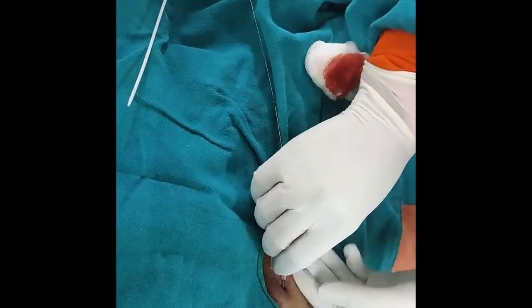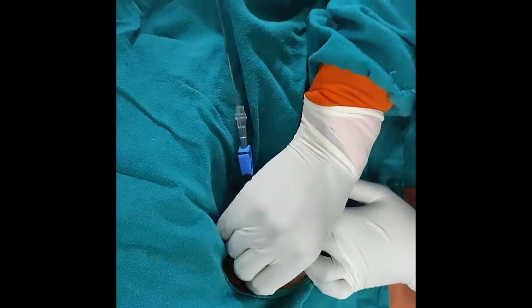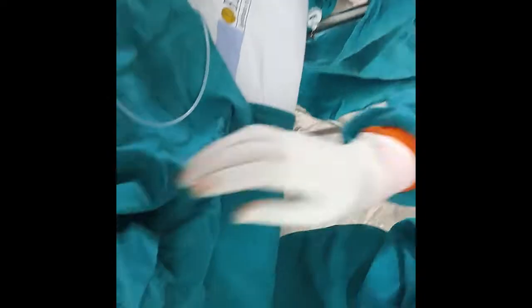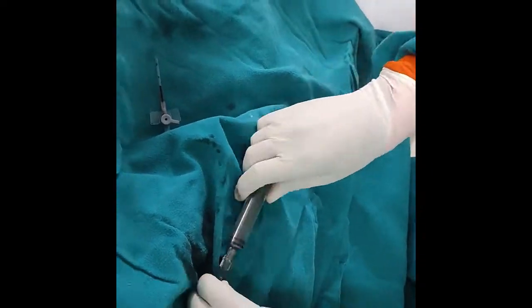I am removing the cannula, and through this guide wire we are inserting the femoral catheter. Now I am removing the guide wire and clamping the femoral catheter. Flush this catheter with the heparin and normal saline mixture so that there won't be any clot inside it.